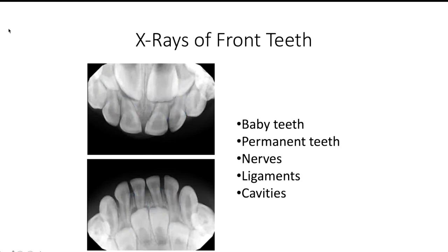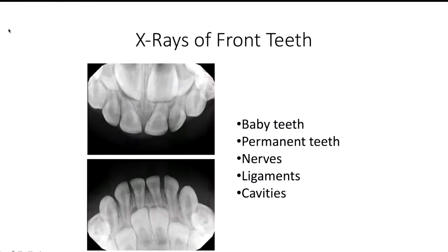And lastly, we will look for cavities. Cavities show up as dark shadows on the tooth, as you can see outlined here. If we take an x-ray of your child's front teeth, we will always discuss all these findings with you at your child's visit.